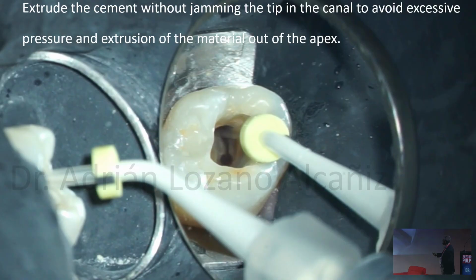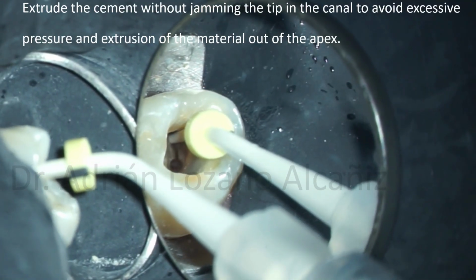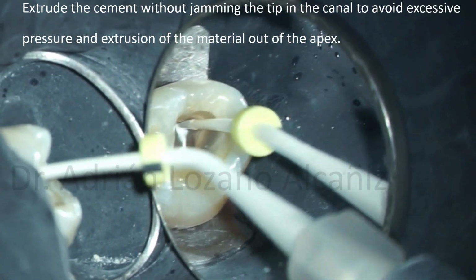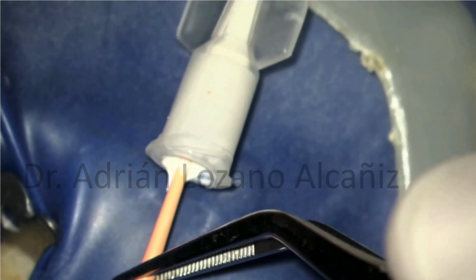So the important thing is not to push the tip of the cone close to the apex, because we can have extrusion of the material. Then we cut a millimeter, and we moisten the tip in the rest of the sealer that is in the tip.